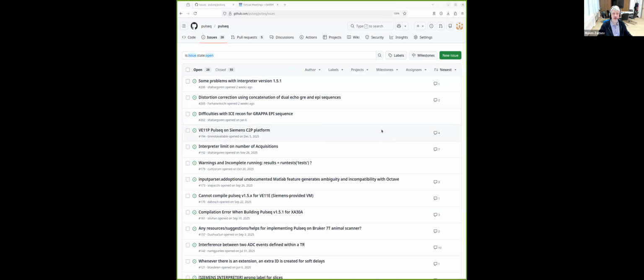In the new interpreter, which we hope to release somewhere in February, we found a way to be much more economical about the way we use memory, shape memory. So many of the sequences which don't run with the current interpreter will actually start running with the new one. So there is a light at the end of the tunnel, but there are also other problems.